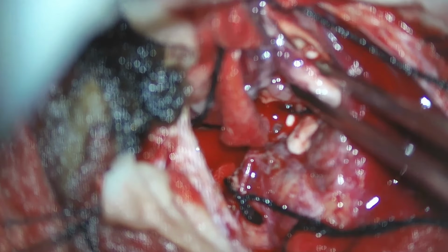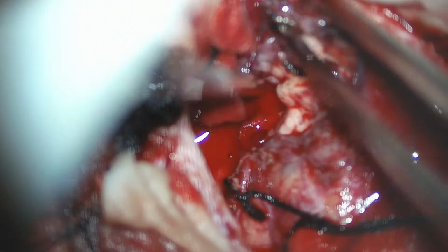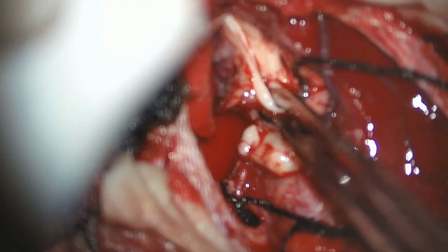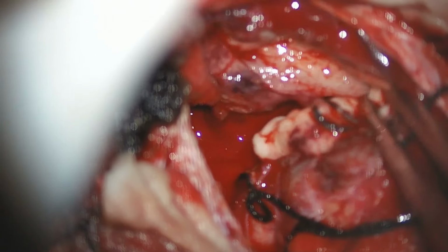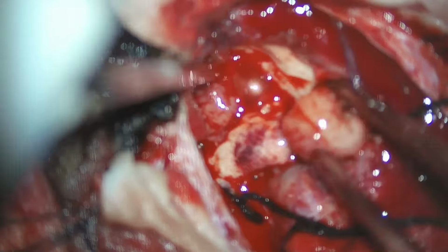Now a major chunk of the tumor from the anterior aspect is being removed with the tumor holding forceps. It is densely adherent to the normal brain. Even a part of normal brain is also being dissected out.